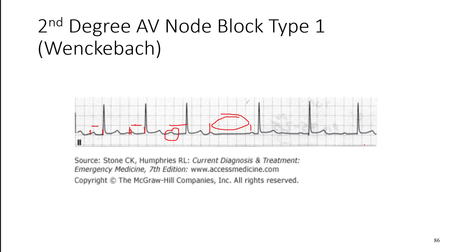Typically this occurs in a routine fashion. In this example, we've got one, two, three conducted beats before it drops out — and you might see that pattern quite consistently, maybe three before a dropout or four before a dropout, with a progressively increasing PR interval.